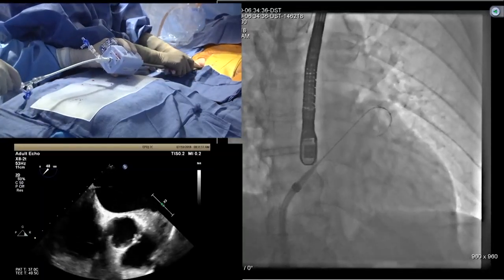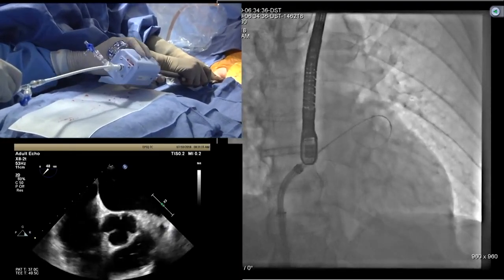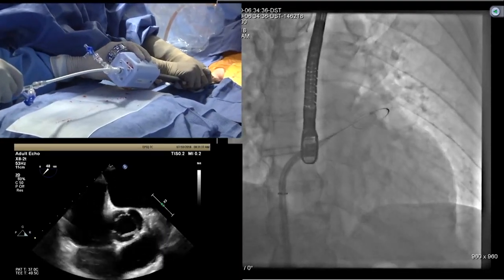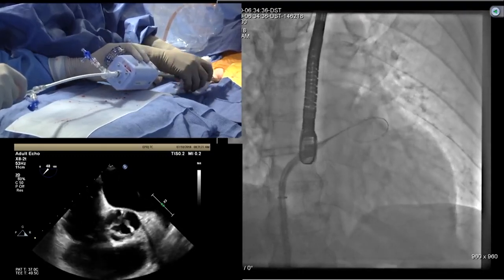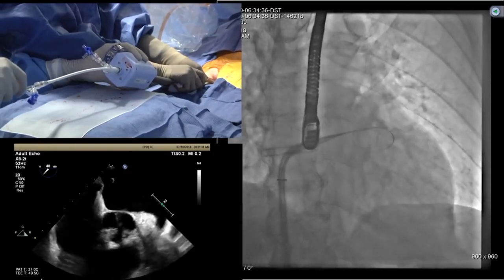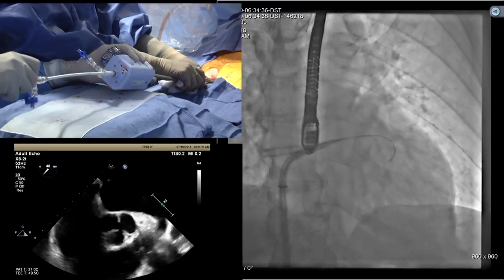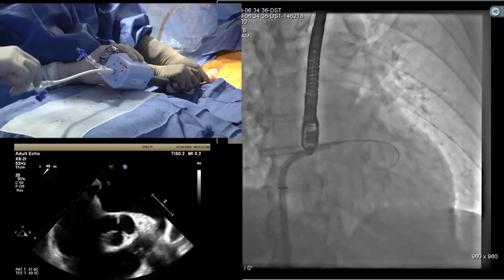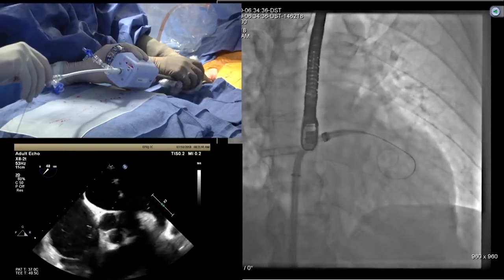Now the thing is, Gila, we are coming in. Can you see us? Yep. Did we cross? No. I think it's a thick septum. Not sure where the guide is. I think you're tenting, but you're not crossed yet. Yeah, I think this is a little thick septum. Maybe you have to do some rotation. Good. And okay, now it's through.